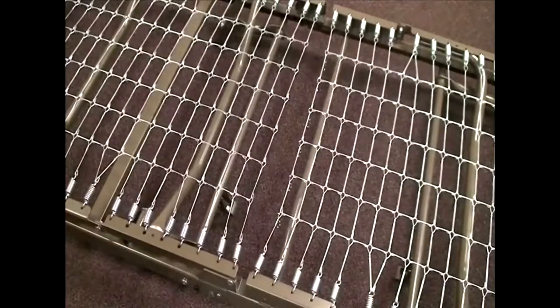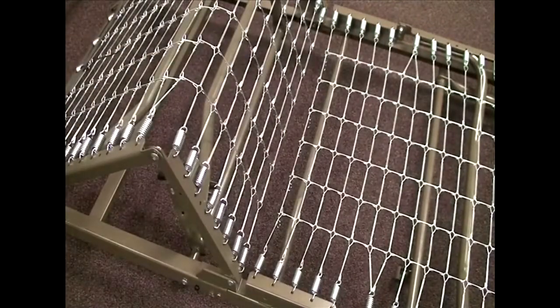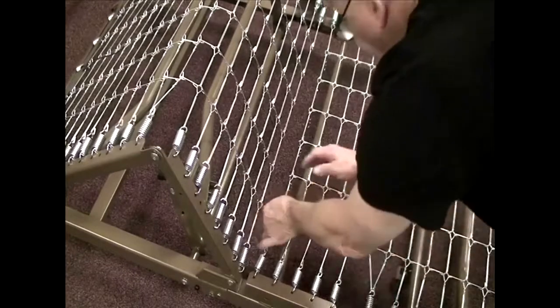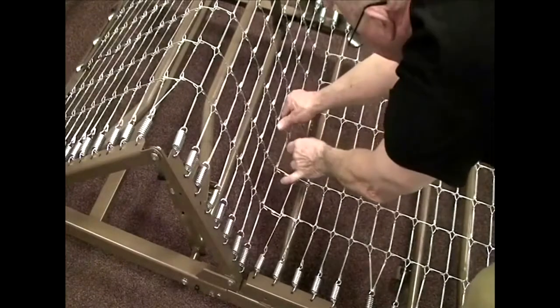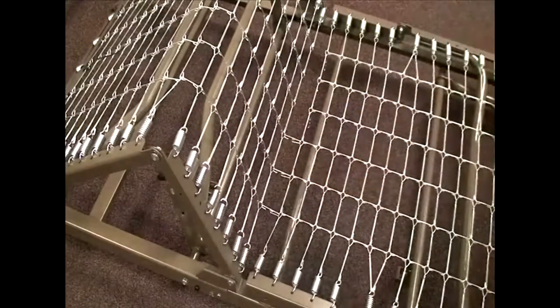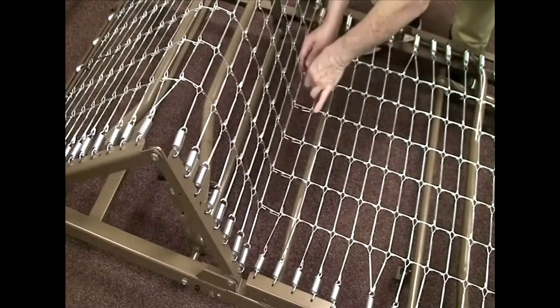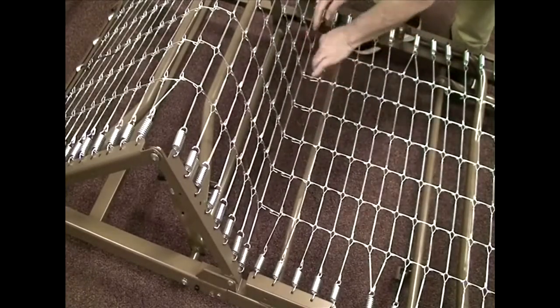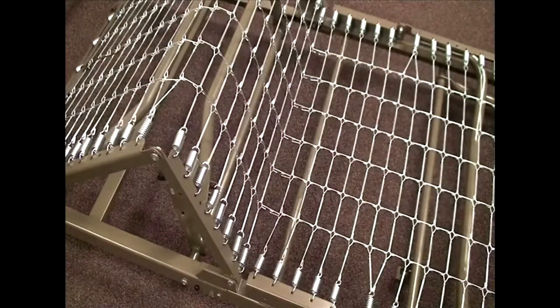We are now ready to connect the springs. Lift up on the foot section to release the tension, then take the hooks from the head section and hook them into the loops in the foot section. You can now lower the foot section back down in preparation for installing the headboard and footboard.